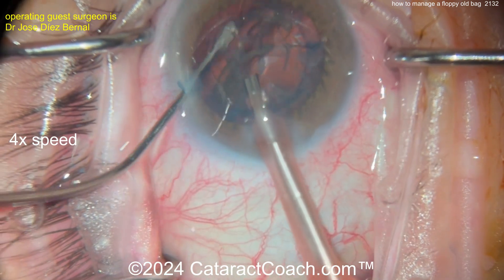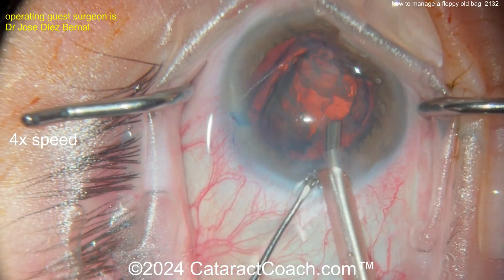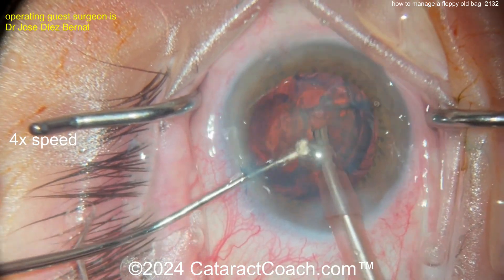Now be careful — the bag is, of course, floppy. Once you stop weighing down the bag with lens material and get all the lens material out, you get that epinuclear shell up — boom, the whole bag wants to come up. Look how much the rhexis is moving; it's not even round anymore. The surgeon made a beautifully round rhexis, but now it looks oval or ovoid — because of the zonulopathy.